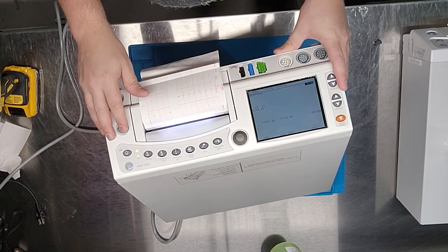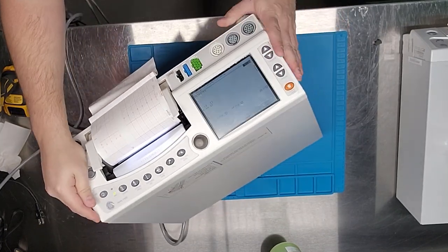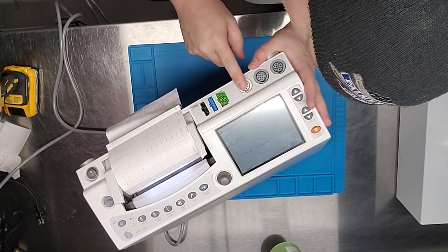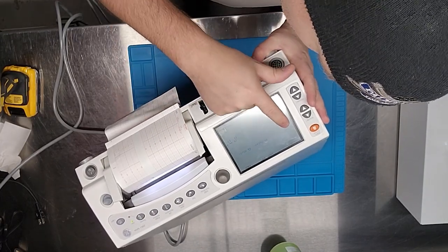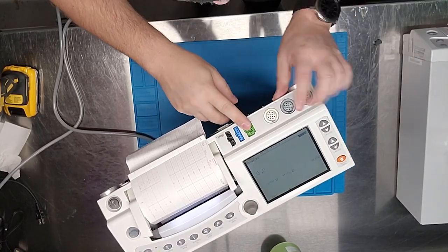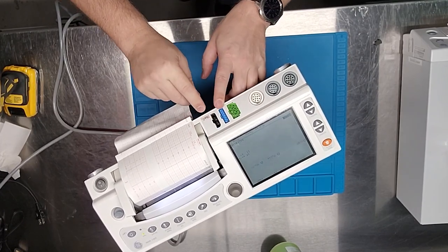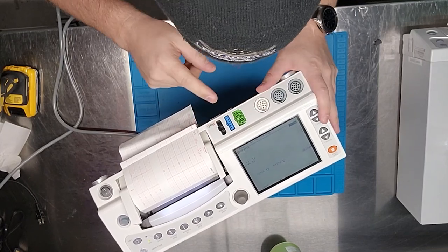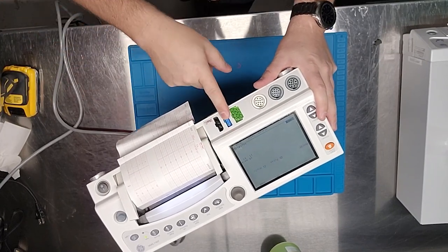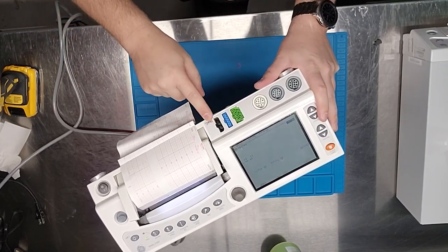There are different ways to stop the printer, including opening it up, but that will throw an error code. Status codes appear on the display — right now it says 'in op.' Your toco reading is over here, and you've got NIBP and pulse for SpO2. Interestingly, these units come in both Masimo and Nellcor configurations — pay attention to the symbols, because this one says Masimo SET.